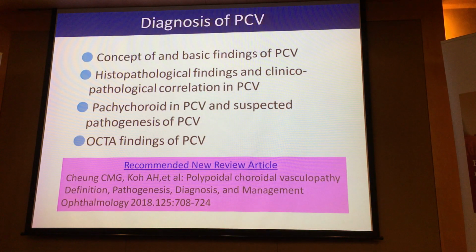So this is the end of my talk. I talked about the concept and basic findings of PCV, the pathological findings and pathological correlation of PCV, the suspected pathogenesis of PCV, and OCTA findings of PCV.